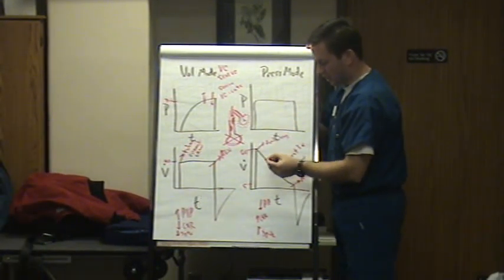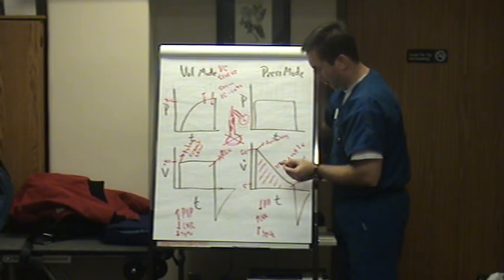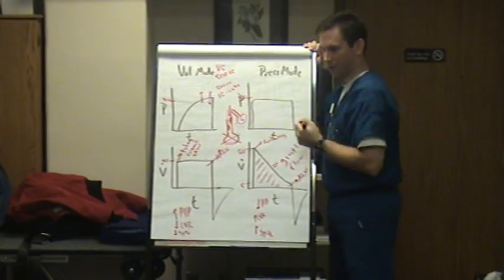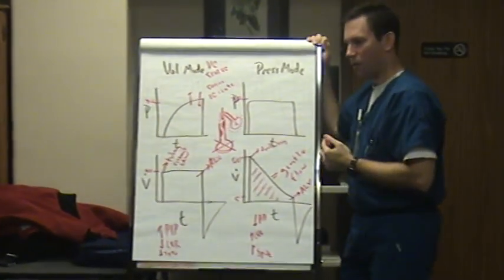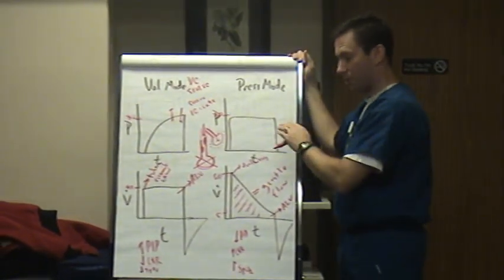So not only does changing into a pressure mode allow the flow to change shape and be gentle on the airway, but it allows you to control the pressure. For example, you can now set the pressure at 30. Alrighty? So if I walk out of your room, she's intubated by the way, I walk out of Dr. Whitlock's room and she's in pressure control.